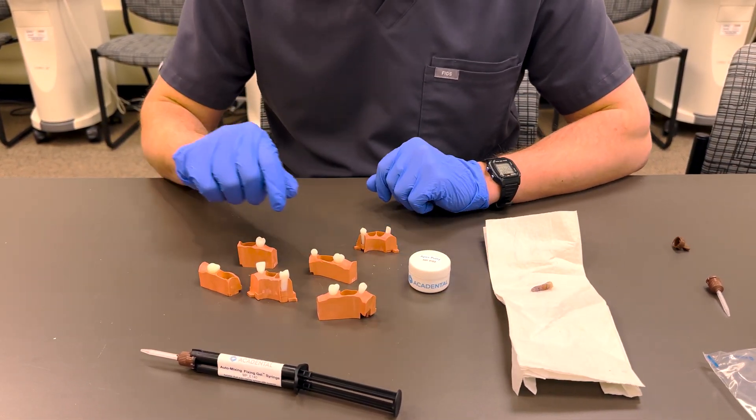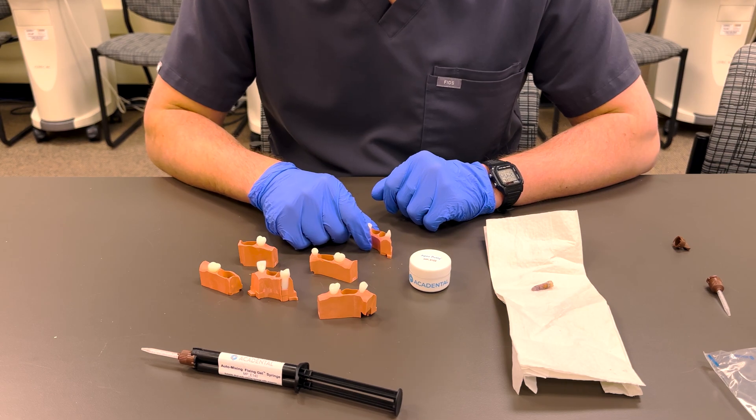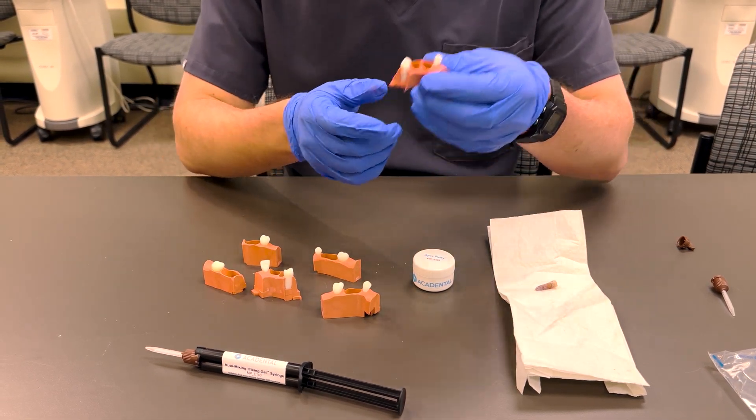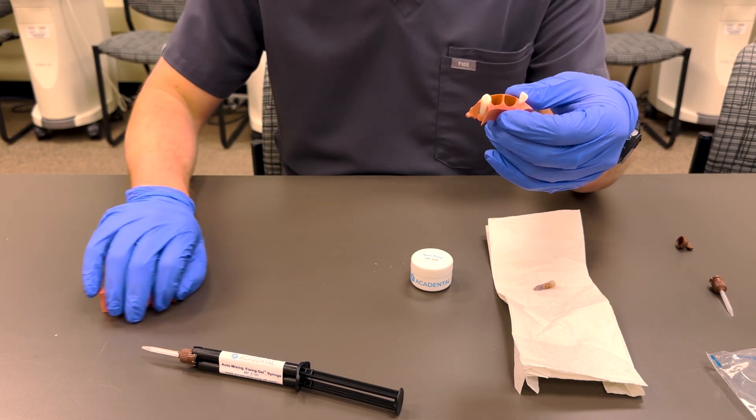What you're going to do is first choose which sextant you're going to be using. It's whichever one matches the tooth you're doing, which in this case is this one because we're doing a mandibular premolar.